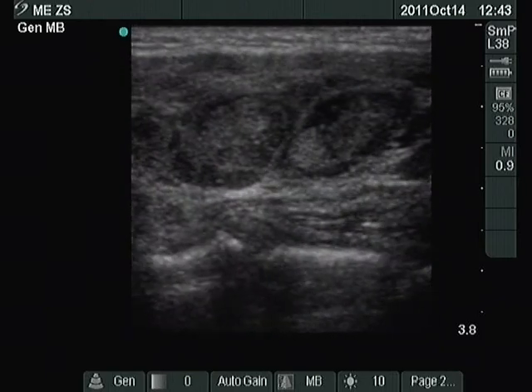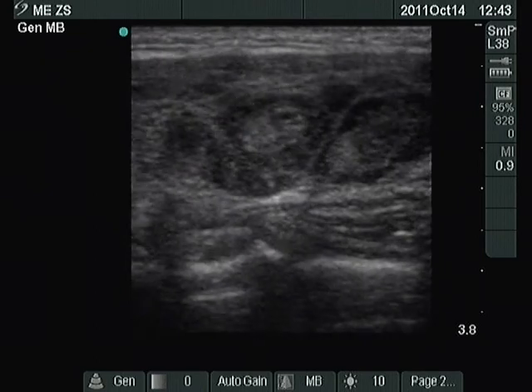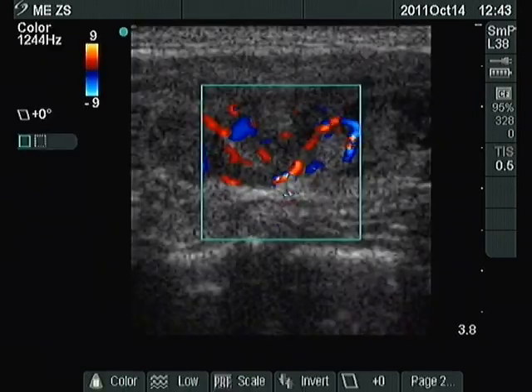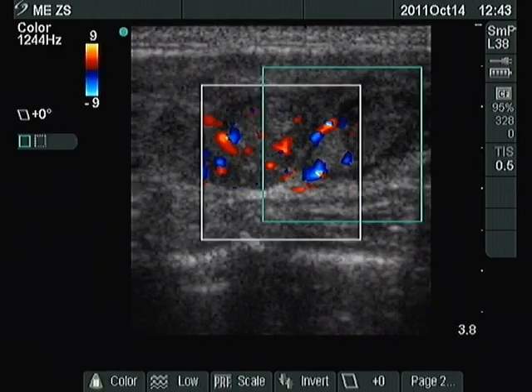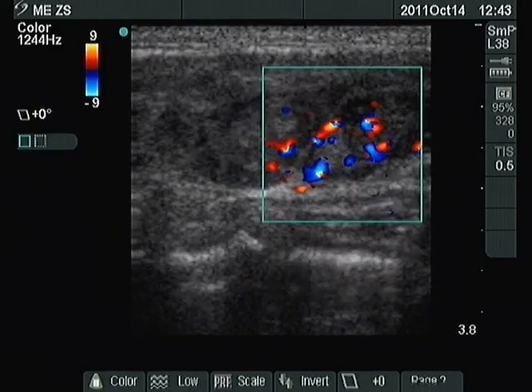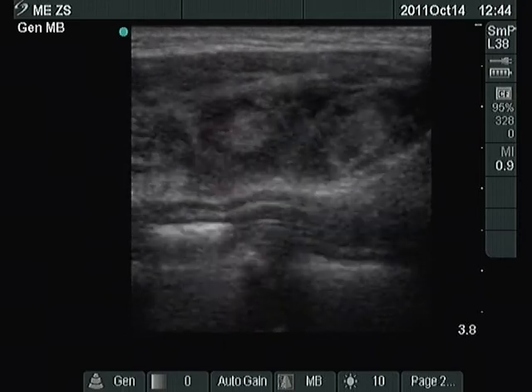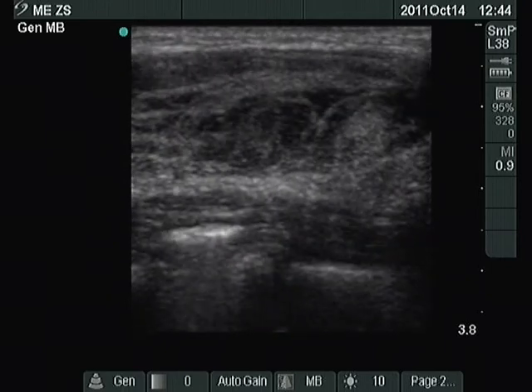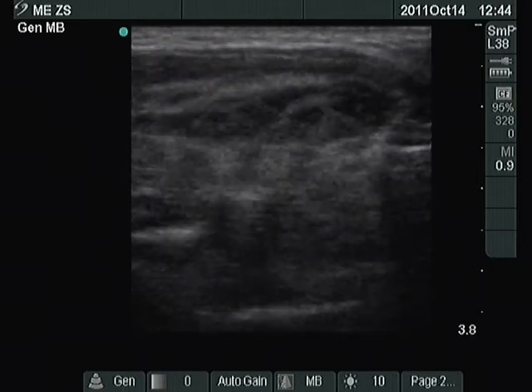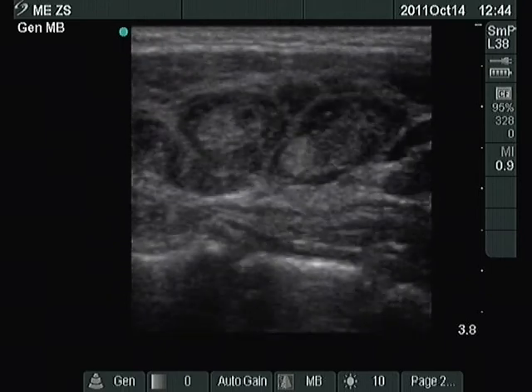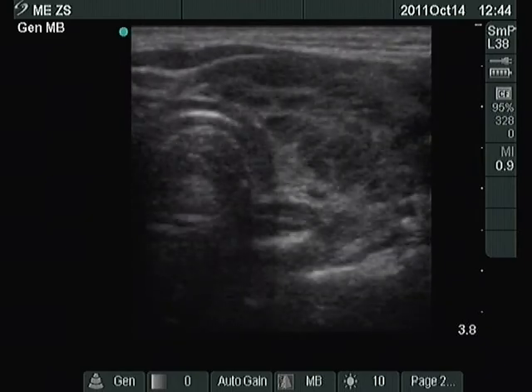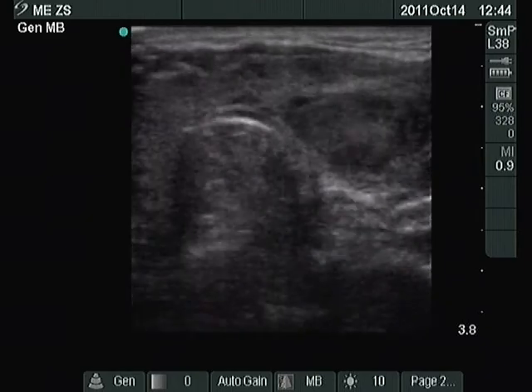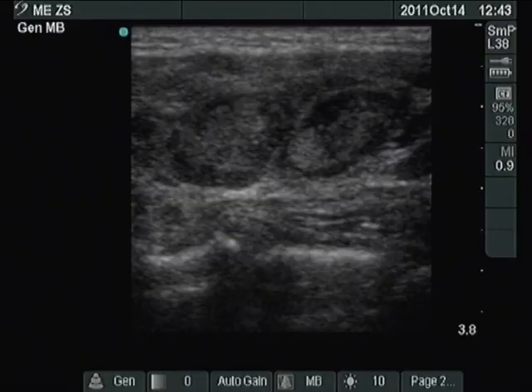it seems possible that there is a large hypoechoic area in the central part of the lobe which is divided into smaller ones by fibrous tissue. The smaller hypoechoic lesions within this area correspond to secondary or tertiary lobules less influenced by the underlying thyroiditis.